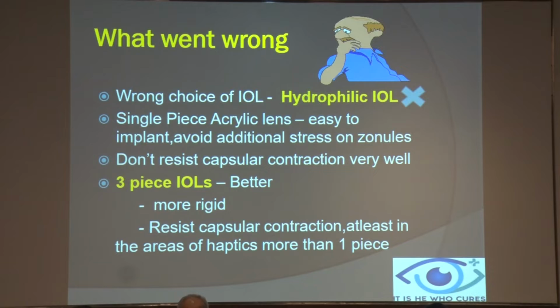And therefore, for these cases, we should have implanted a 3-piece IOL, which would have been a better choice. They are more rigid. They resist capsular contraction and therefore prevent capsular phimosis.